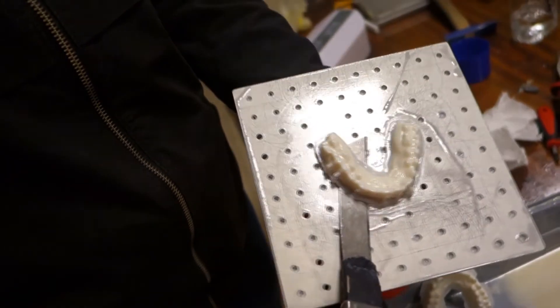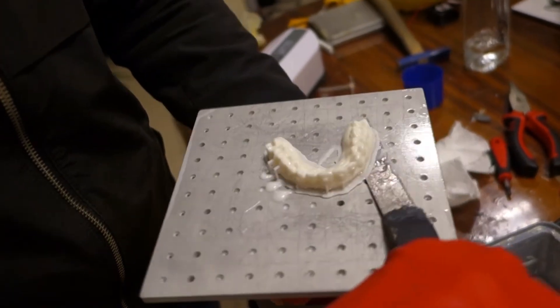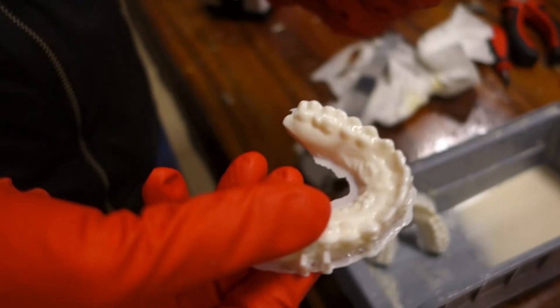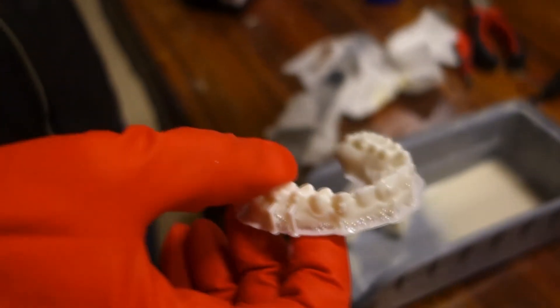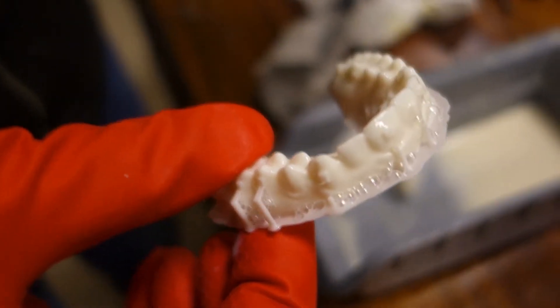Our print is ready. My friend is going to take it off — he's wearing kitchen gloves but they do the same job. He simply takes the printed part off the plate just like that. From here it goes to the washing and cleaning stage, and then I'll show you how we do the aligner process.